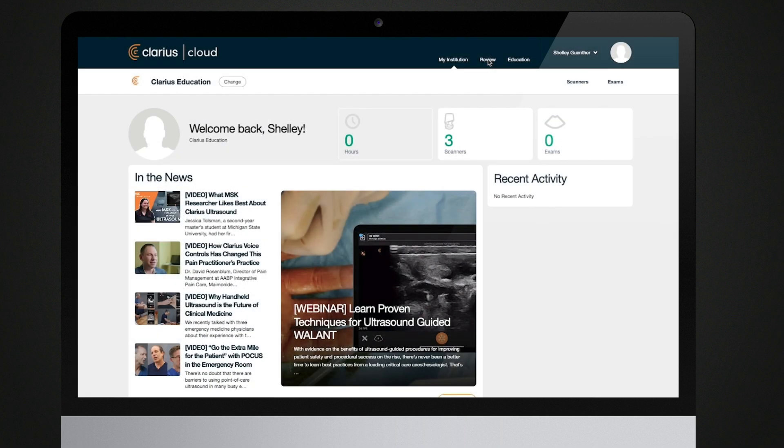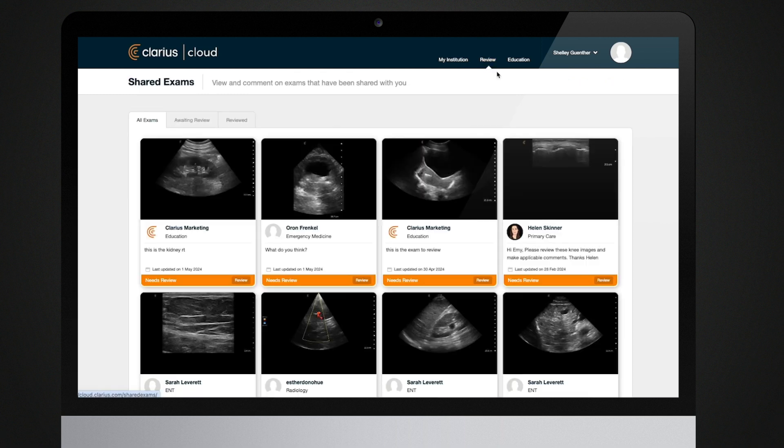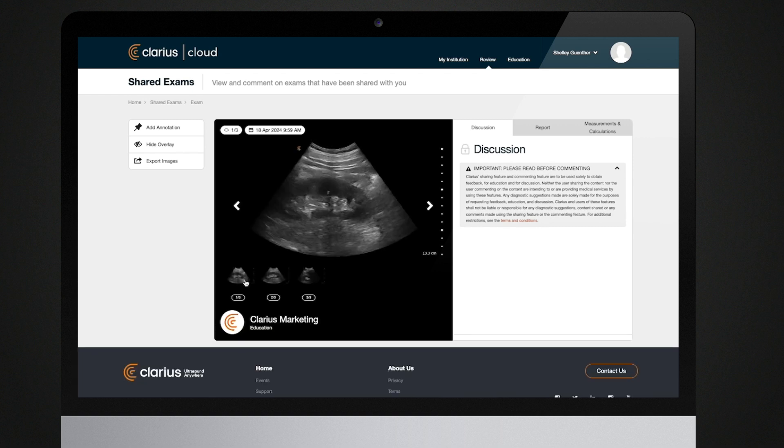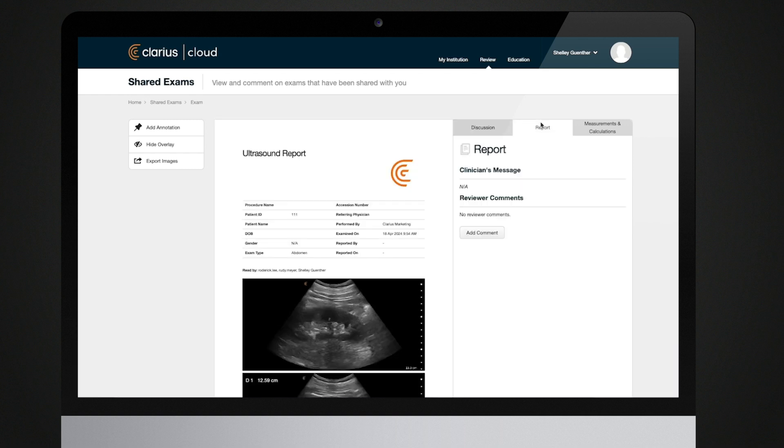You have a limited view of the exam with patient information redacted. Click on Report to submit your diagnosis for the exam creator. You can have a discussion with the exam owner and other reviewers by posting comments. You can also add annotations to the image.